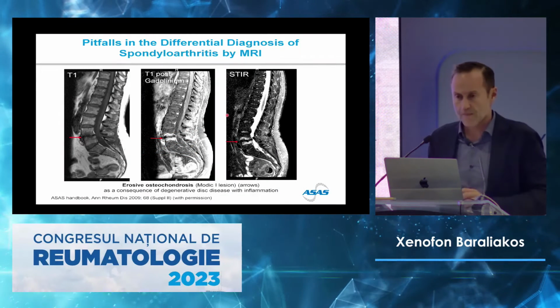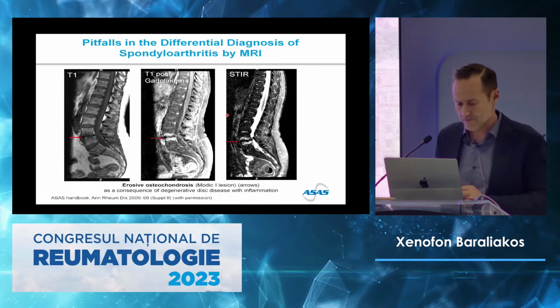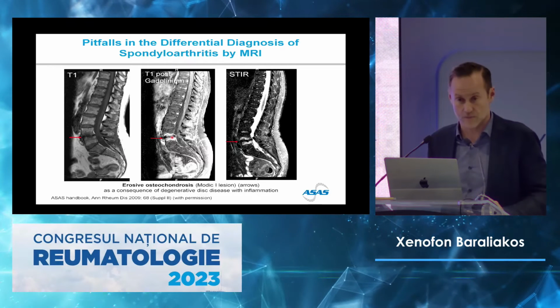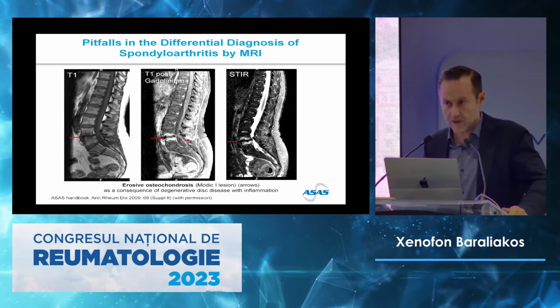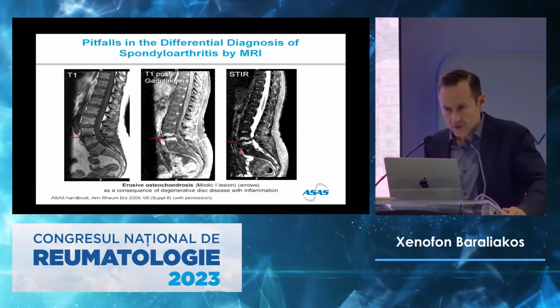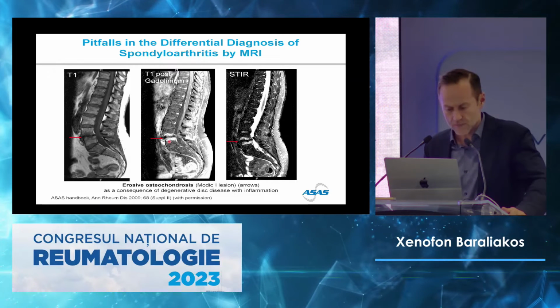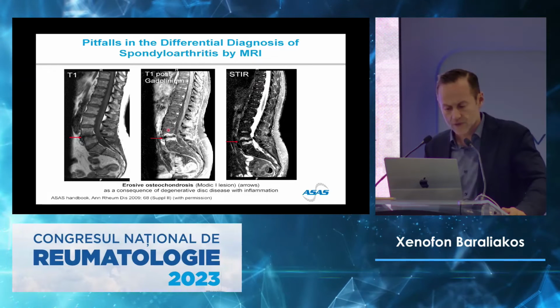And the typical other finding of bone marrow edema that has nothing to do with SpA is where you have not only the edema, but also no disc anymore. Now, this is a very advanced, very severe case of a typical osteochondrosis. It is also erosive. You see here there are some erosions. More important for me here is to show you that the pattern of the edema is important. So the osteochondrotic edema is really going alongside the end plate.